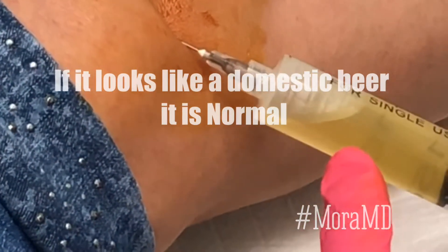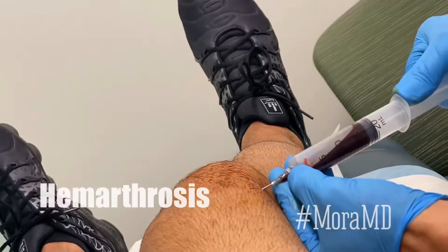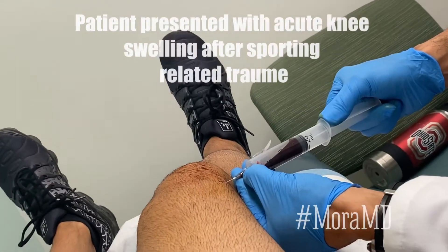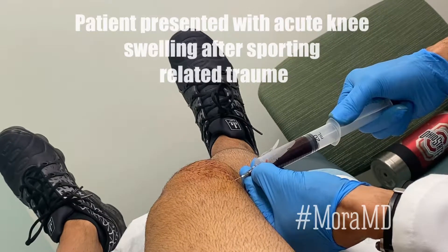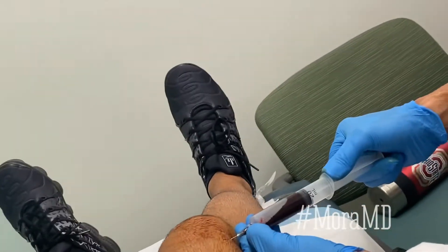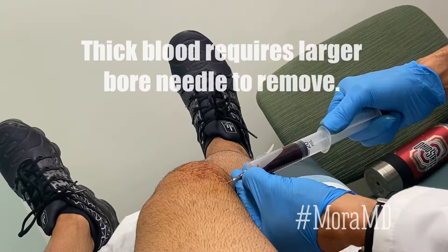See how it's still flowing out — this is a normal looking arthritic effusion. A hemoarthrosis tells me that something is injured, so because of this information I would not recommend injecting anything that's going to numb the knee up for days.